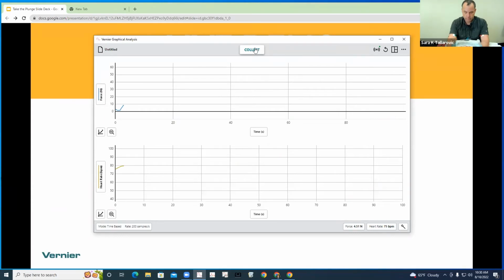And earlier today, when he was putting on those electrodes, you note he put them kind of high up on his arms, and that's to make sure that they're not plunged into the ice water. We don't want the EKG tabs to be submerged, or the wires. So placing them high on the forearms and putting the hand in ice water, or somewhere on the biceps on the upper arm, anywhere is really fine, as long as they're up and out of the way of getting the sensor wet.